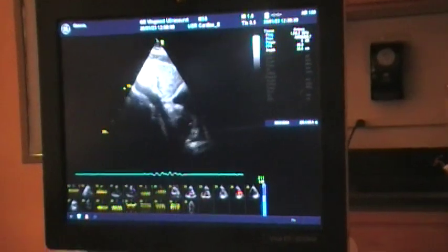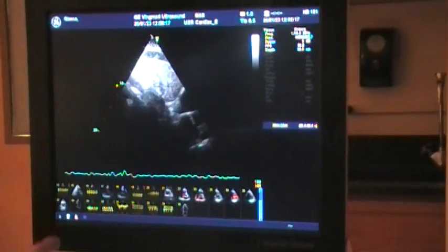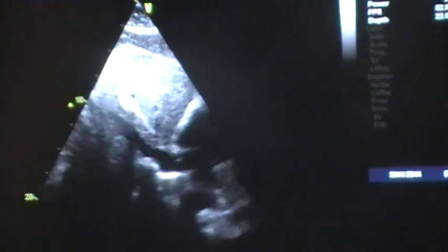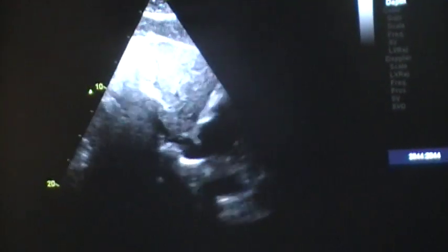You can see there. So if I'm pointing towards the patient's left a little more, I'm going to have their aorta here. You guys should be familiar with that. Of course, your image looks backwards from what you're used to because we've got their head up here now and their feet here. So aorta, I'm going to angle towards her right, and here's her IVC. There's a hepatic vein. This is important because you want to know how well that IVC collapses. So in this view, I can see hers collapsing over 50%, which is what we want to see.